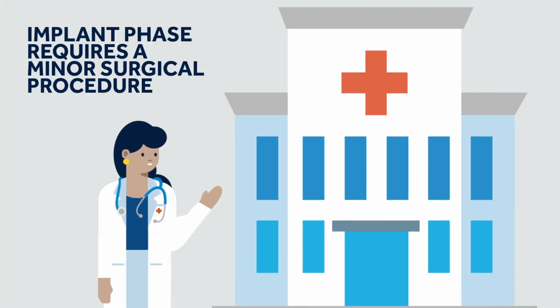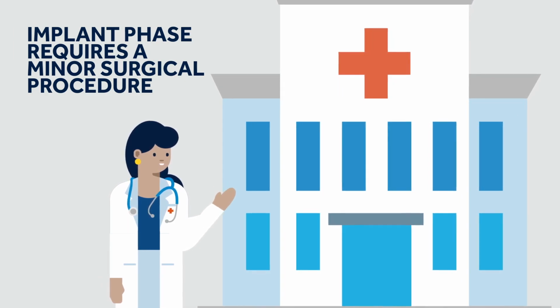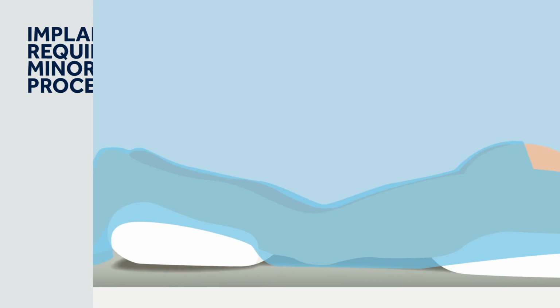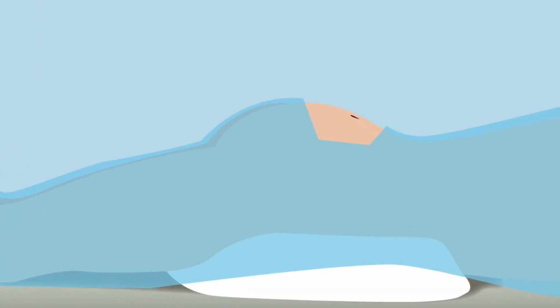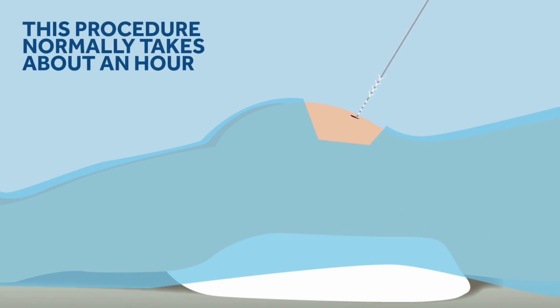Now, let's turn our attention to how the system is implanted. What can you expect with the implant procedure? During the procedure, you will be lying on your front. Some cushioning will be used to make sure you are comfortable. Your lead, a thin wire, is inserted in your lower back and positioned near the sacral nerves in your pelvic floor.